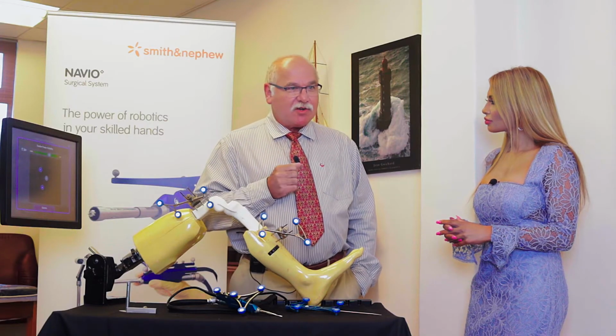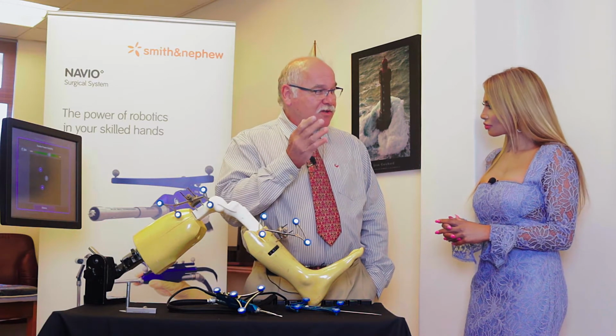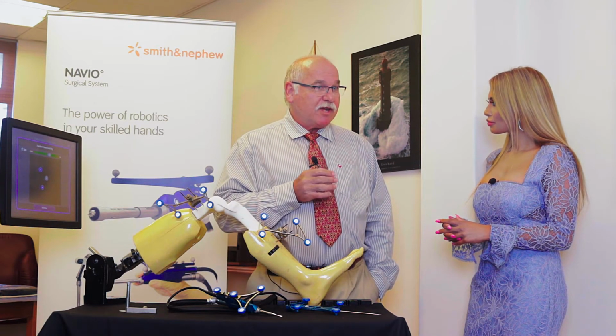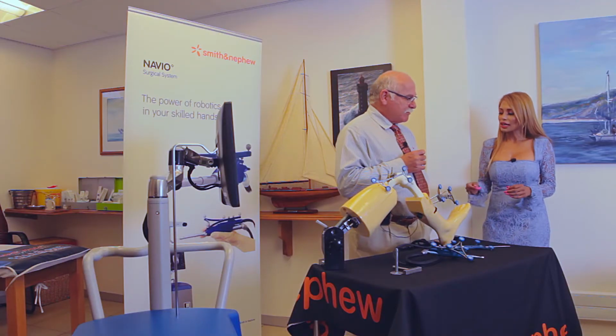It's all about data collection. You look at the x-rays, you assess the x-rays of the patients beforehand and see what they look like, look at the different angles that are applicable, and then you come to the live surgery part where you collect the data in real time on the table. You don't need an MRI beforehand, you don't need a scan, all the data can be collected by the computer robot while you're operating. So how do you get the data?